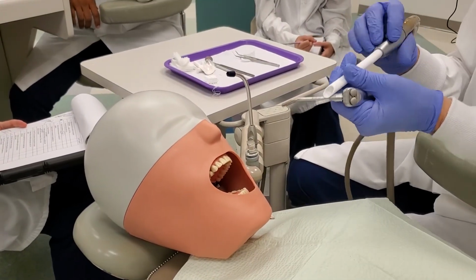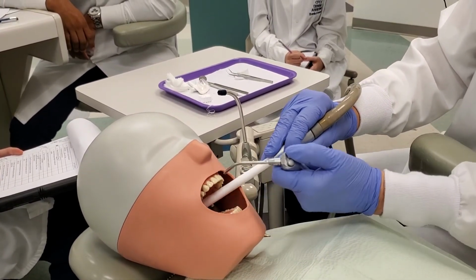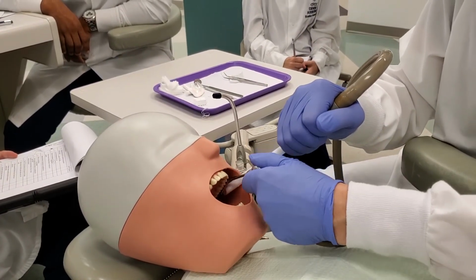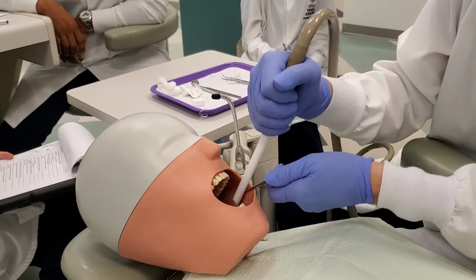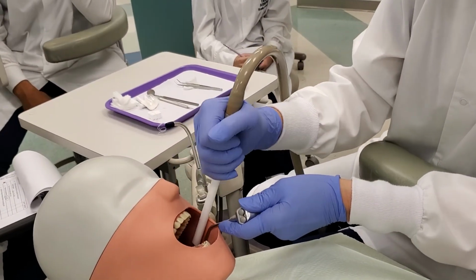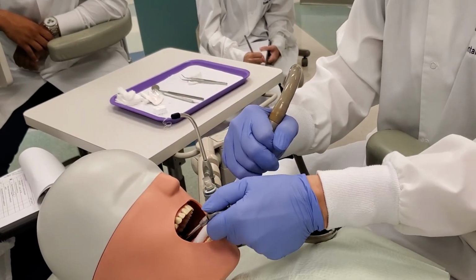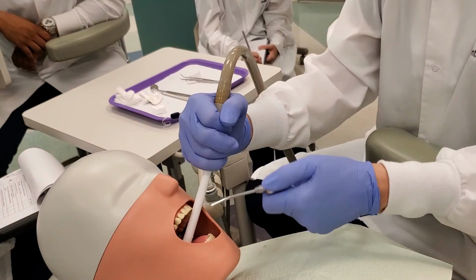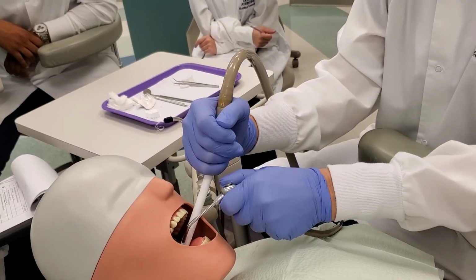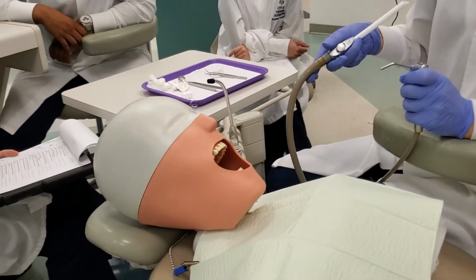So, let me show you. Pen grasp up to the midline and back, and then do the air. Okay? Retract, place, up to the midline, back, retract, get the water out, place, up to the midline, back, retract, get that extra water, retract the tongue if you can, place, retracting, back to the midline. I hate this tip. Okay? I'll get all out. That's a full mouth rinse.